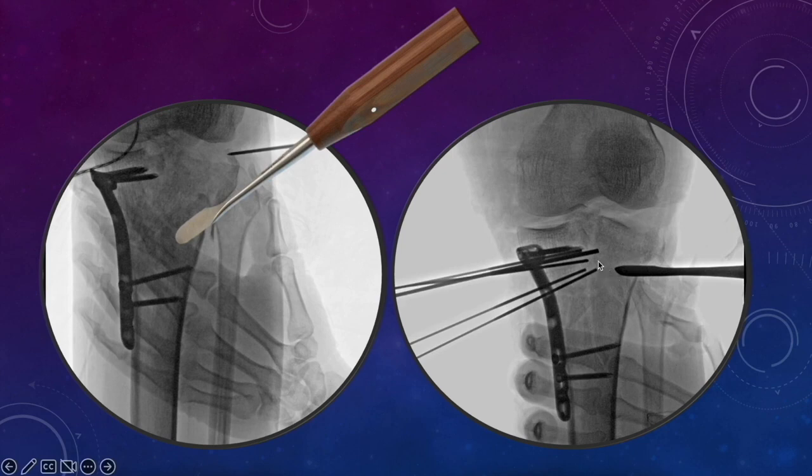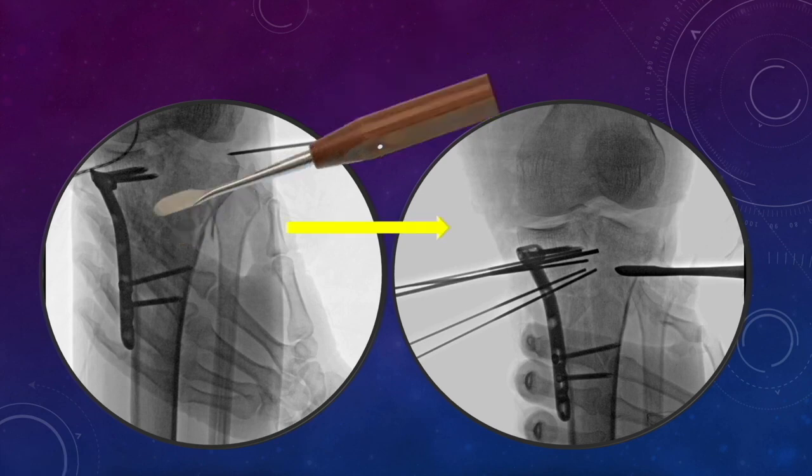When you are doing that, keep your K-wires ready from the medial side. So the moment you are able to reduce it properly, you are able to lock this fragment in position with multiple K-wires from all over the area on the medial side. That means from posteromedial, medial and anteromedial, so that the depressed tibial plateau fragments on the lateral side are secured in position. So you have to scoop the periosteal elevator or any flat instrument like an osteotome like this, so that the subcondylar bone which was impacted here comes proximally, because that is the good bone in which you get a good screw purchase.